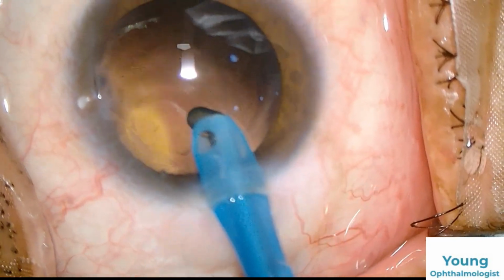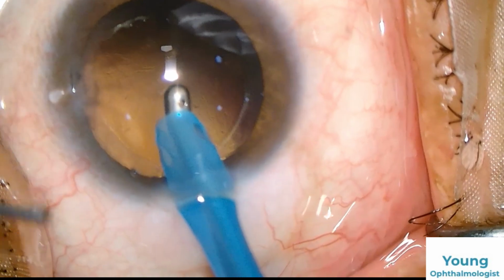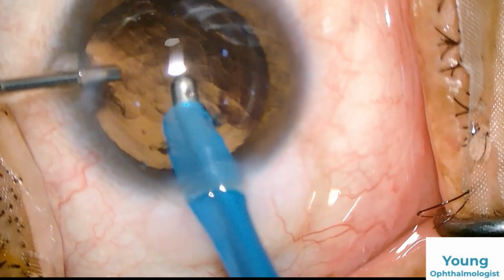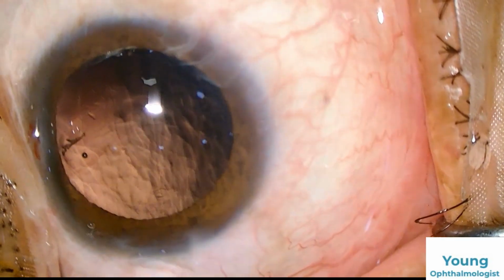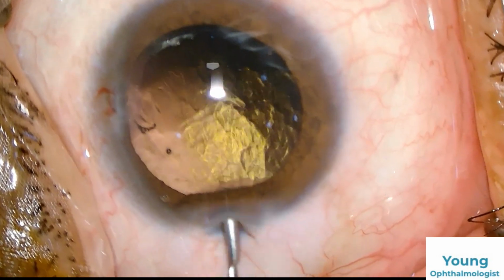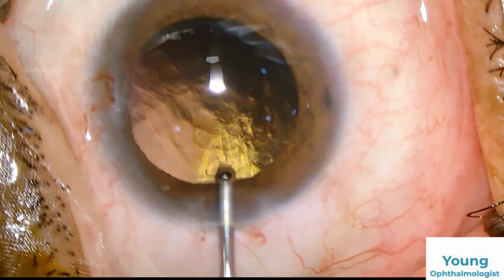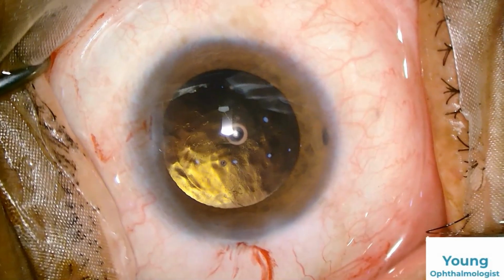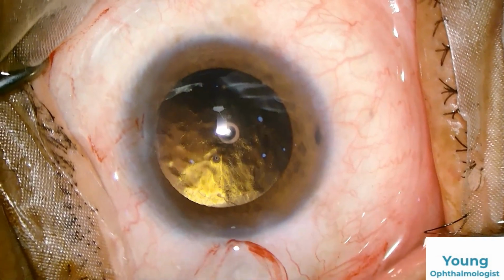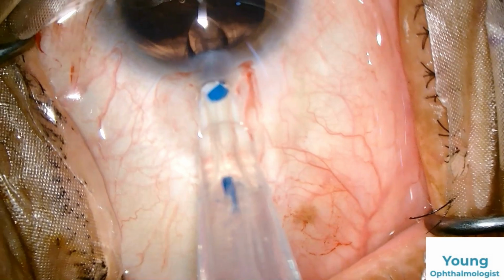My coaxial has a bend at the end. It's not a straight coaxial. Subincisional cortical wash is easy with it. Again, pushing visco as I was suspecting some component of polar cataract. Your case is never finished in polar cataracts until the patient is out of the OT. Even after putting the lens, while forming the chamber, you can have a PC rent. So in any case where you are expecting any polar component, you should take care at each and every step of the surgery. Now we are injecting the lens.